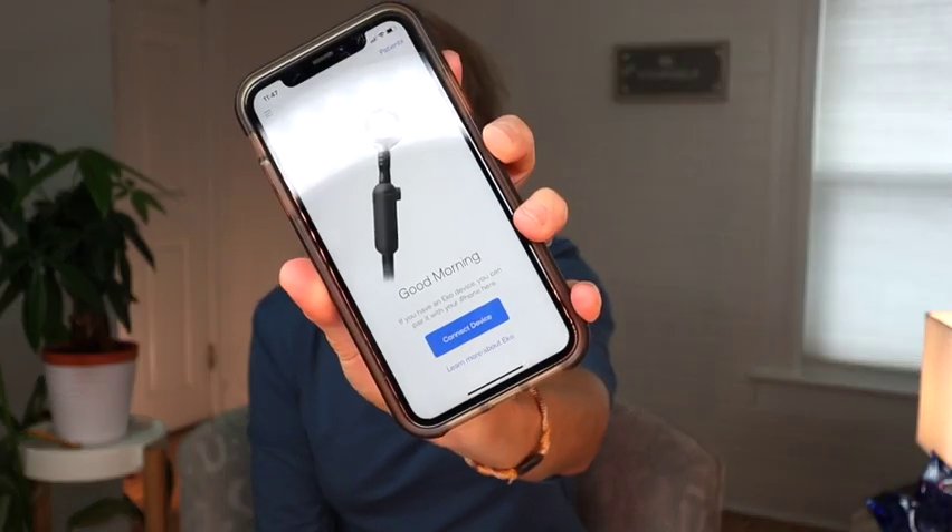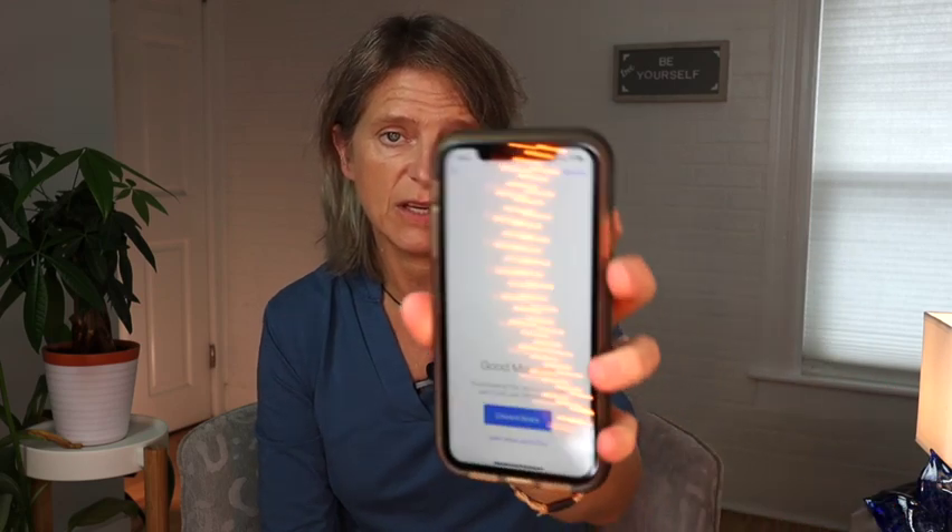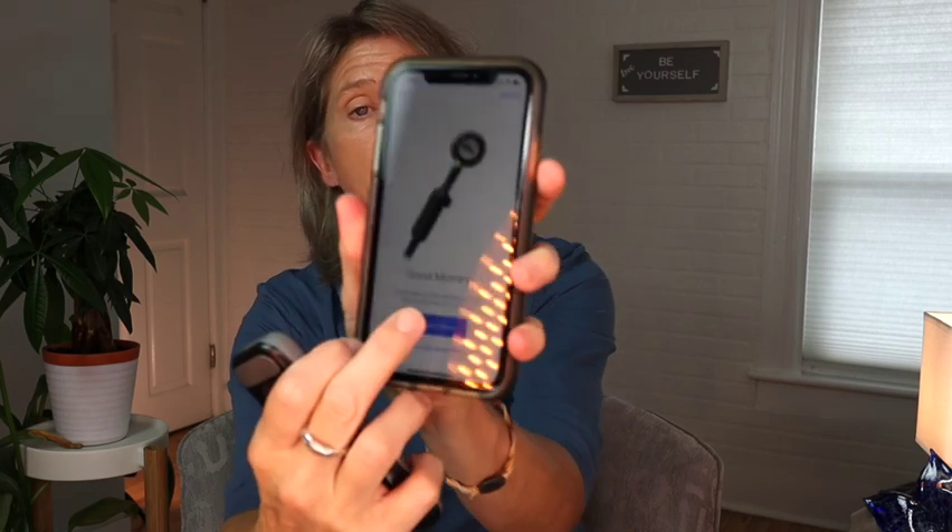The third setup connects the Duo through the Eko app on my phone to my Bluetooth hearing aids — the Phonak Paradise. I open the Eko app, which lets you connect the Eko Core or Eko Duo. I make sure my phone's Bluetooth is connected to my Paradise hearing aids, then I turn on the Duo by holding the button for two seconds, select it in the app, and it connects. Once connected, I can hear everything through my hearing aids — it's pretty loud when you touch the device.